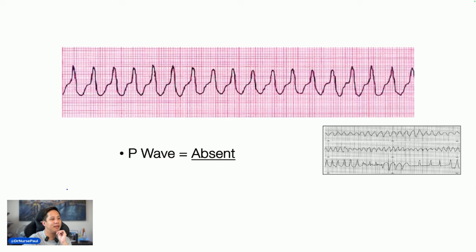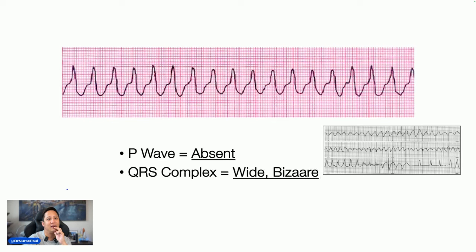Do I have a P, anyone? Hello? Do I have a QRS? A lot of QRS, and they're wide, right? Do I have a PR?